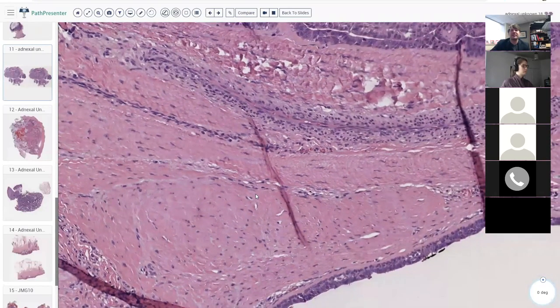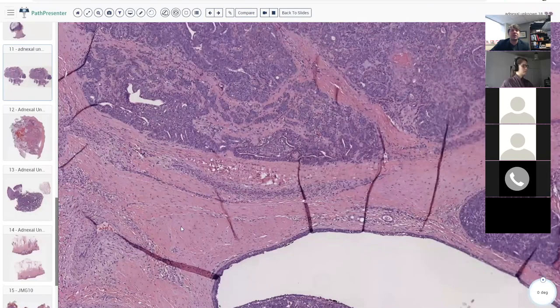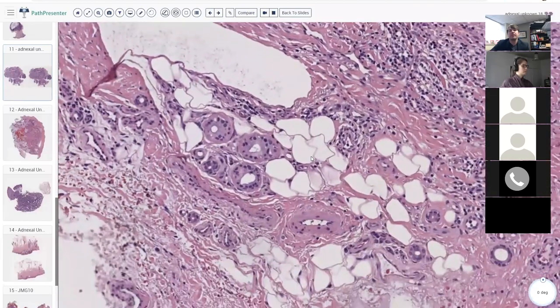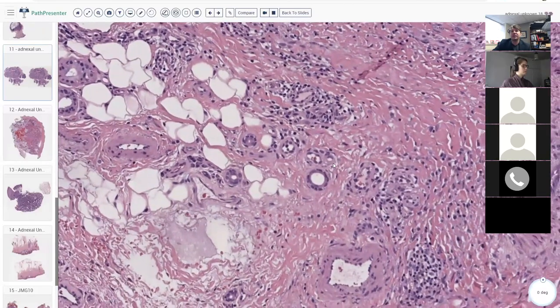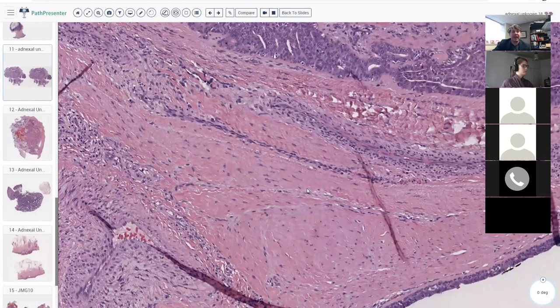So "ramenoid" — I coined that today. Once we put it on YouTube I'll put a paper and cite it — this is how the world works today. Anyway, where are we going to have fascia or tendon? Here's subcutis. How do I know this is subcutis? These are eccrine coils. When you see eccrine coils in fat this close to tendon or fascia, you're almost always in the acral skin — hands or feet.